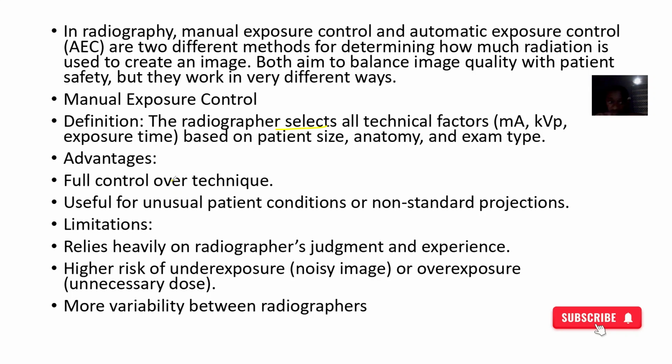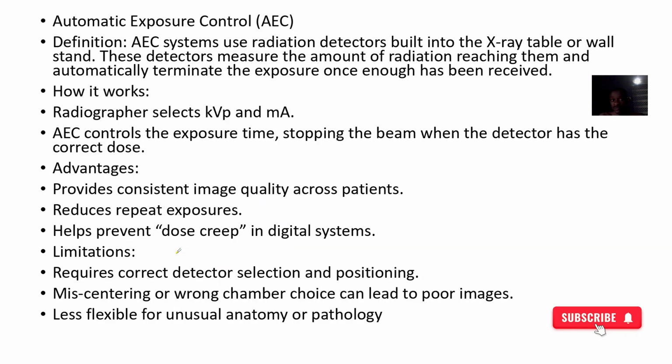Do you understand? It's useful for unusual patient conditions where the radiographer has to think. But one of the limitations is that it depends solely on the knowledge of the radiographer. If the radiographer is not fully armed with knowledge, they could actually miss it out.